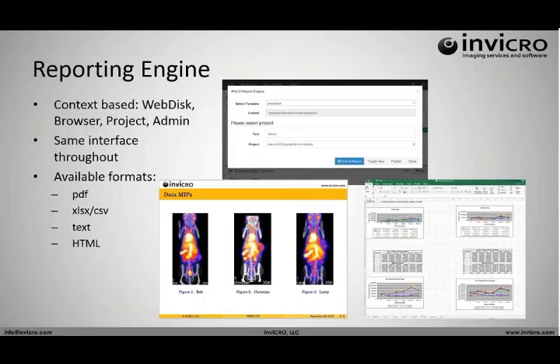If you do it from the browser page, you select the data sets that get sent into those reports, and then you generate these forms that you see right here. It's basically the same flexibility, but an easier way of kicking off reports than we previously had.